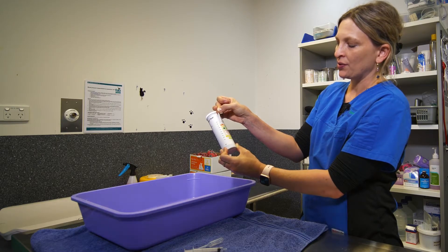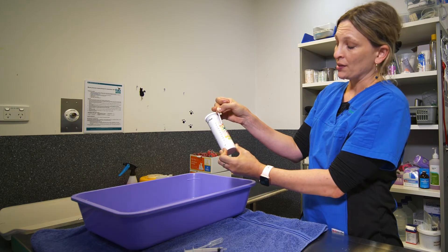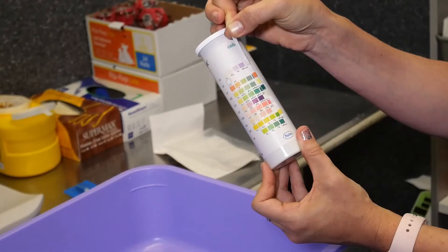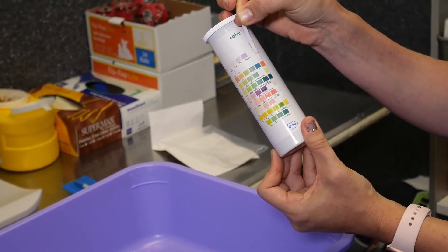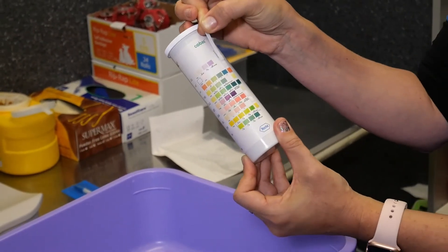Next we go down to the glucose strip. I've actually just used a glucose solution here, but you can see that the glucose is a very very dark green — so 4+. Now if your cat is diabetic then this would be an expected result.